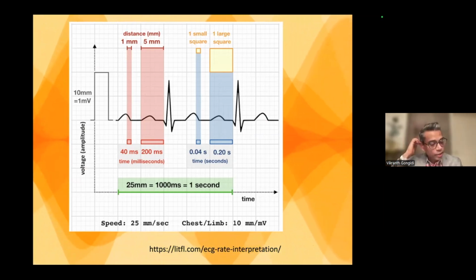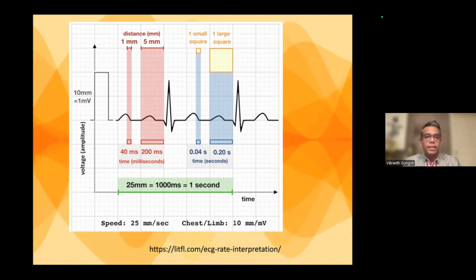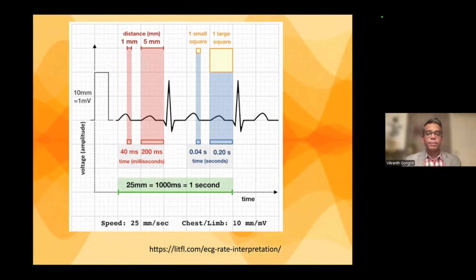It's a very good website for medical students and residents. Whenever people come on my rotations, I have them go to that website. He has a good tutorial on how to read the EKGs, and if you want challenging cases, you can see some of those cases as well. There are also some examinations and tests you can take to see how good your EKG skills are. But the basic thing with EKGs is you just keep reading and get better at it.